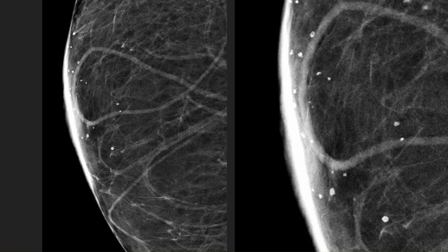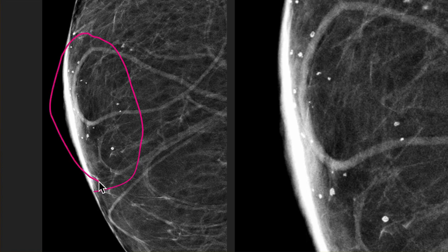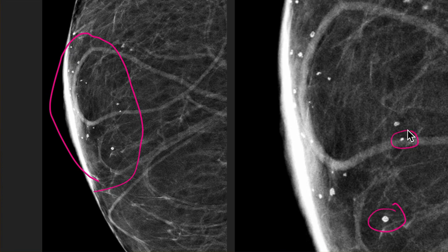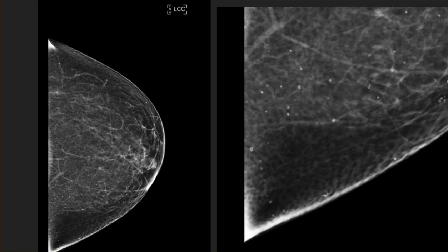Just to show you a couple of classic examples — here they are within the periareolar area, which is a very common area for skin calcs. Here's a screenshot magnification view showing these ones that are a little more lucent or round. These lucent-centered ones are pretty much pathognomonic for skin calcifications.